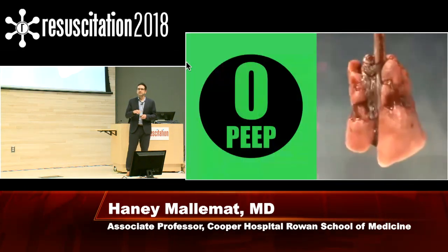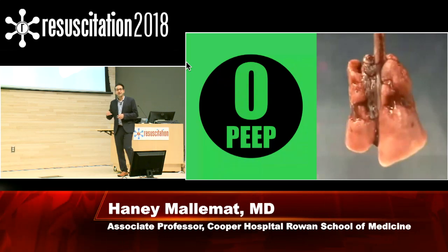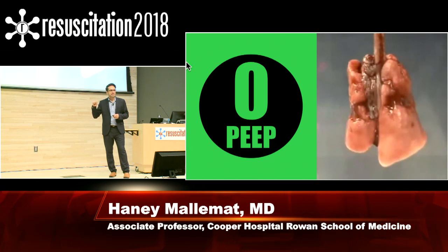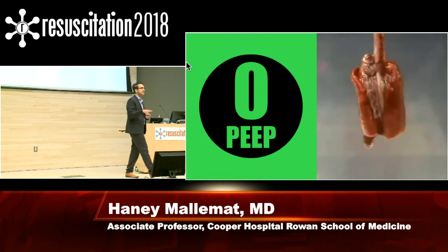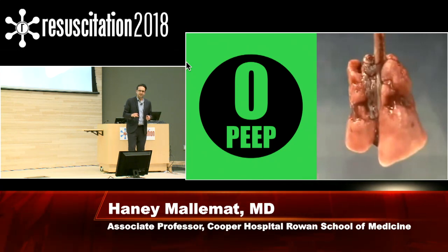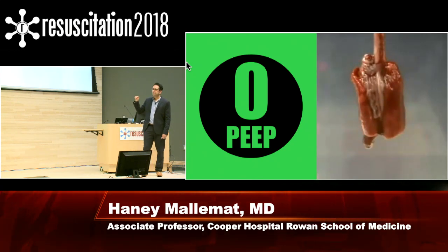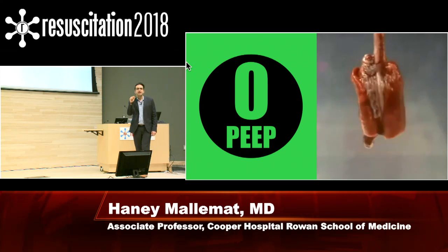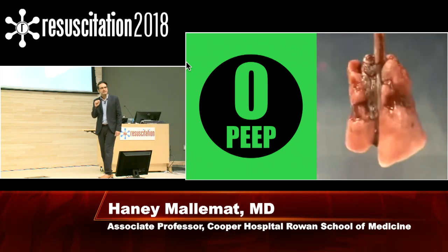So here's a neat little video from YouTube that I want to show you. This is a pig lung, and this lung is completely collapsed down. And look what happens when you don't use any PEEP, when you use zero PEEP, or ZEEP, as they like to say in the business, okay? So look at what happens with ZEEP. You put a breath of air in, it collapses down right back to normal again. And you push air in, it collapses back down to normal.